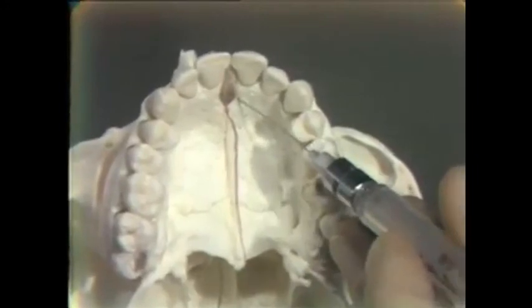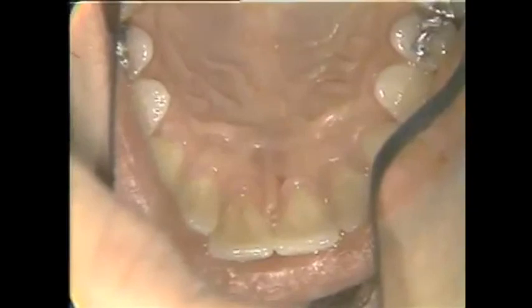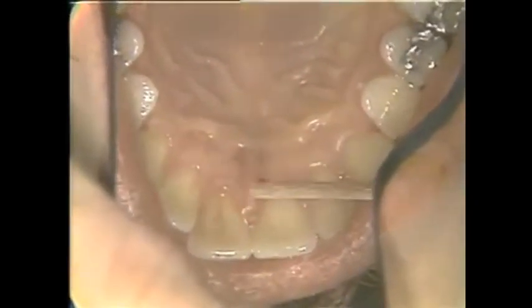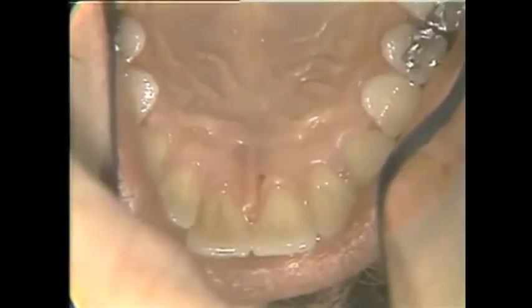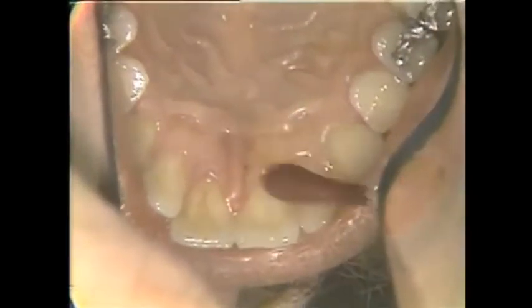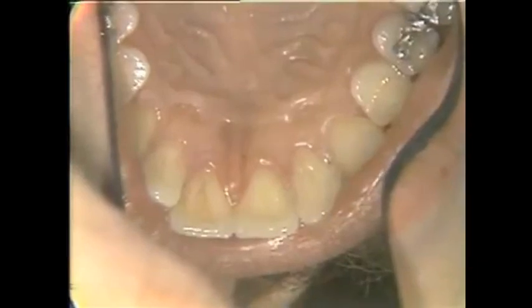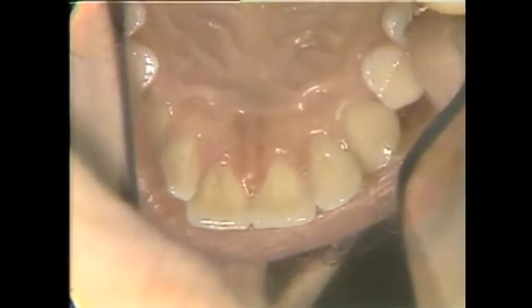This is a mirror view of the anterior palatine area, and you can see the nasopalatine papilla right here very, very nicely. We'll dry our mucosa and apply a little betadine again. And we'll make our injection just on this side of the papilla. It doesn't matter whether you make it on the right or the left, but one or the other. Don't inject directly into it.